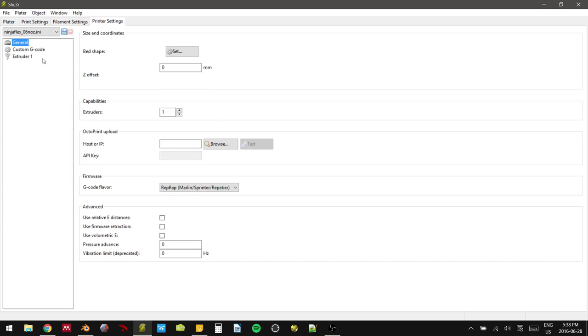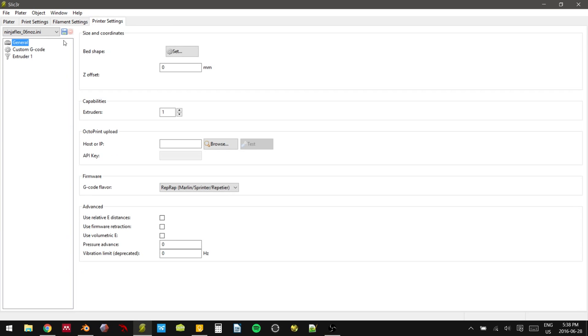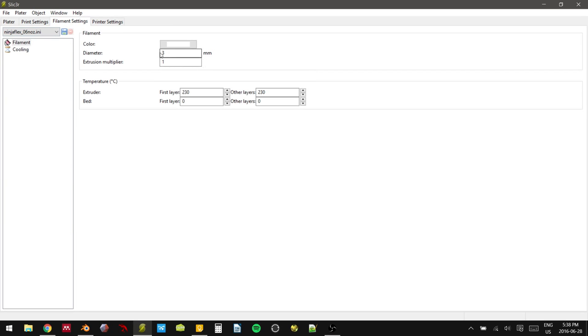The only thing is, you have to be really cognizant of whether or not your printer is accepting a 1.75 millimeter filament or a 3.0 or a 2.89, whatever you want to call it, millimeter filament. All the TAZs use a 2.85 millimeter filament, so we set that here. Well, it's a default 3 because they vary from 2.89 to 3. The MakerBots, for example, are 1.75 millimeters, and I think the Ultimakers are 1.75. I'm not 100% sure, so check before you set this.